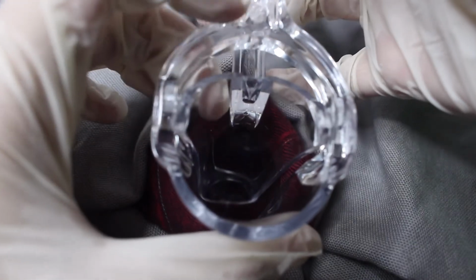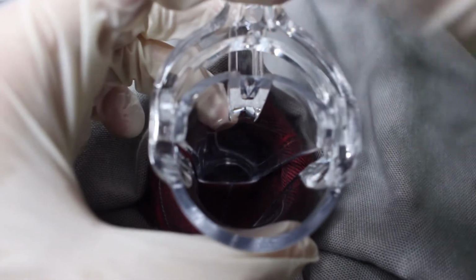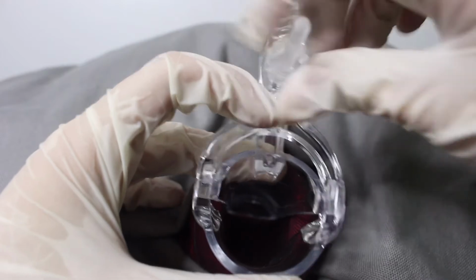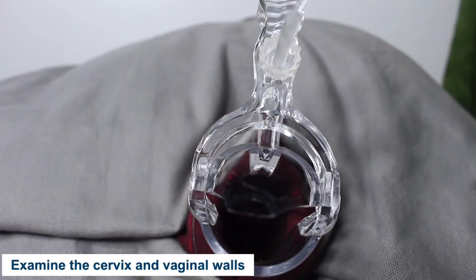Open the blades midway through the vagina to avoid hitting the cervix. Once the cervix is visualized, the speculum is opened and the introitus is widened. This can be done by using the screw adjustment on the base of the speculum. Examine the cervix and vaginal walls.